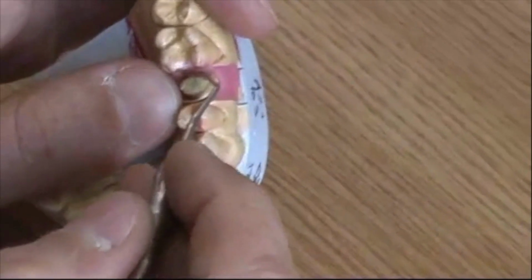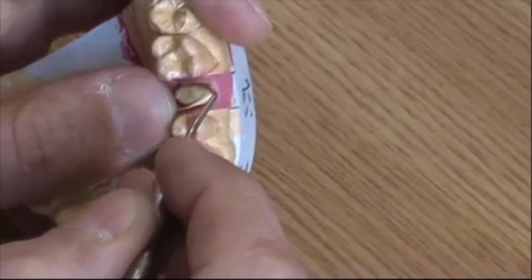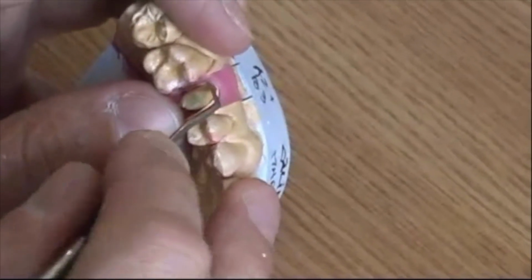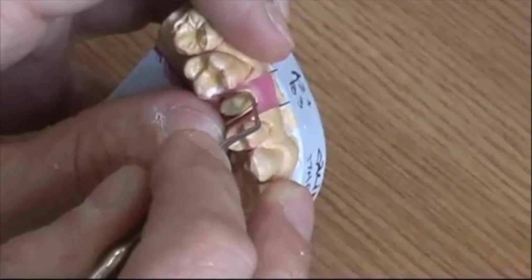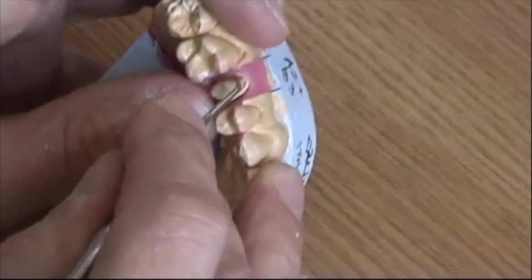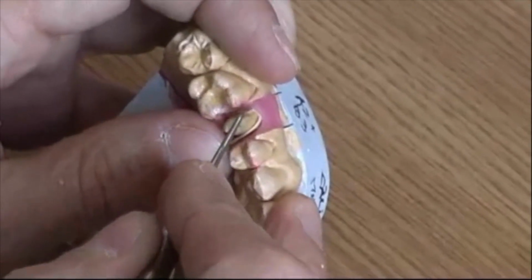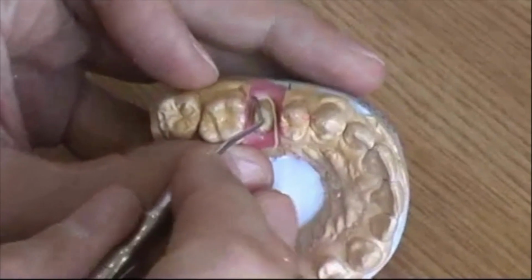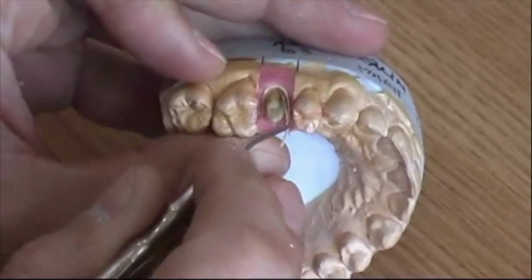This is a retraction cord. I don't like this retraction cord. I haven't been using it for 10 years now, but anyhow, this is a very old movie. That's a cord that has copper inside, and it's kind of difficult to place. This retraction cord, we place it there in between the gum and the preparation, the abutment, at the cervical zone, to allow the impression material to capture nicely the margin of our preparation.